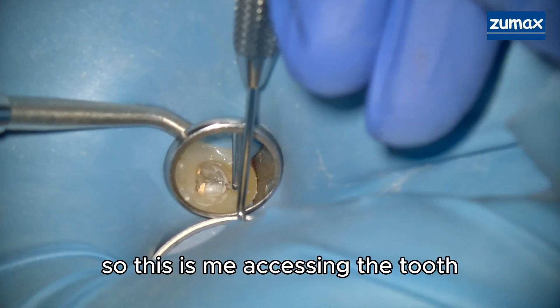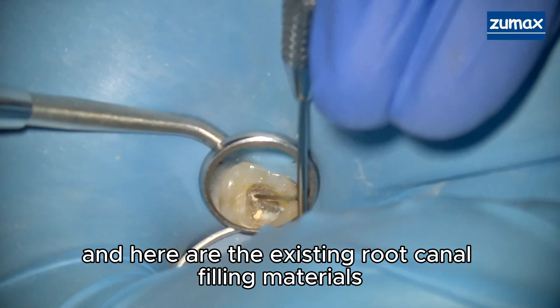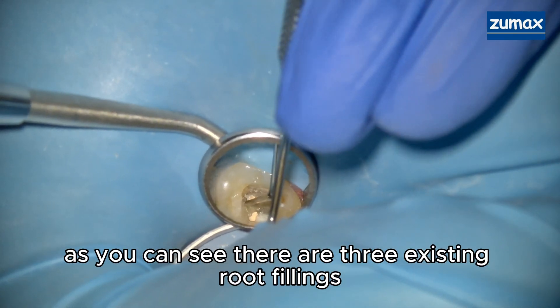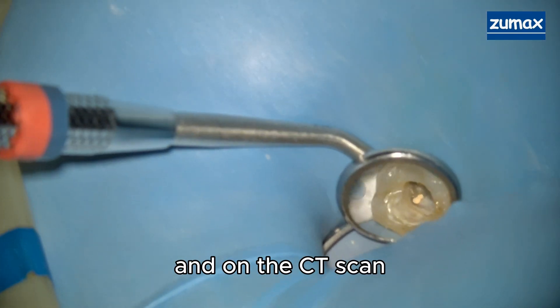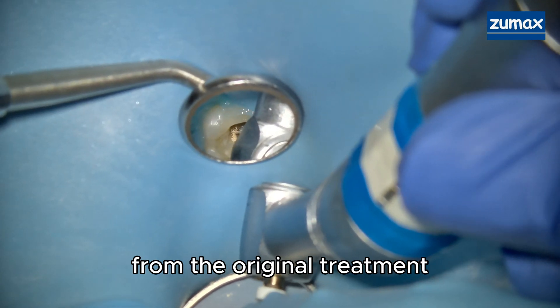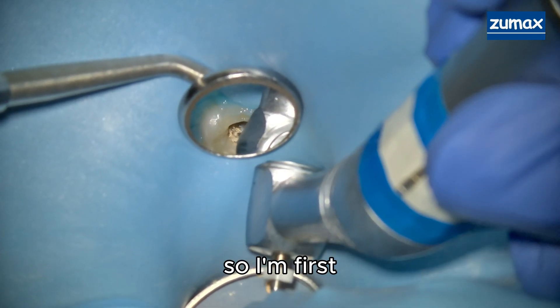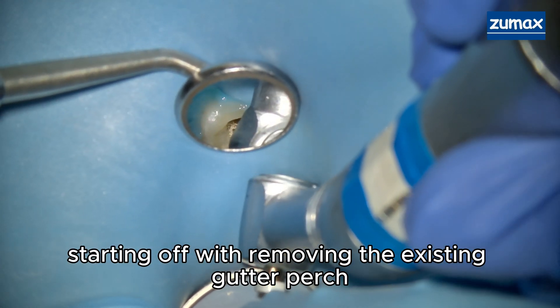This is me accessing the tooth, and here are the existing root canal filling materials. As you can see, there are three existing root fillings, and on the CT scan there was a fourth canal that was missed from the original treatment.